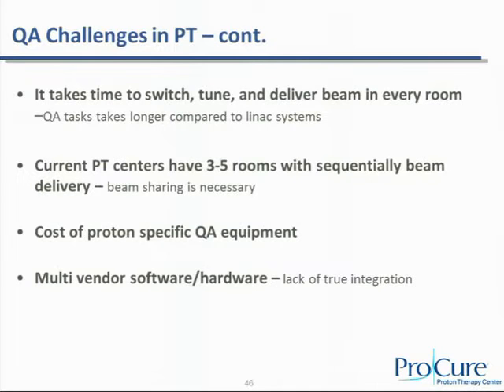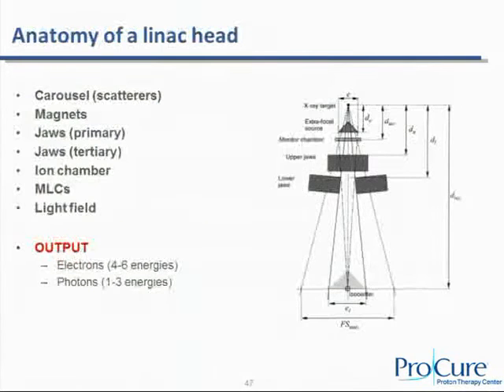So you can imagine that if one software is to be upgraded, you have to do regression testing to make sure that everything else above and below that software, or communicating with that software, is still working. And that's not an easy matter because, again, we are in the development phase. We are still maturing as a field, so these upgrades are very frequent, much more frequent than what you would expect in an X-ray clinic.